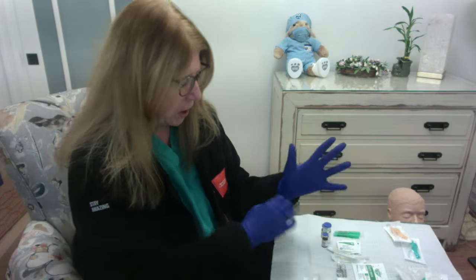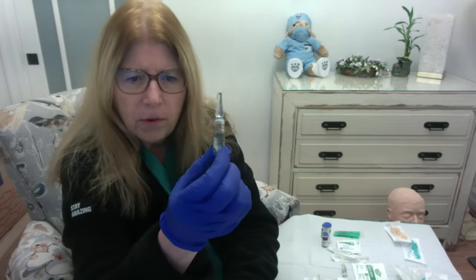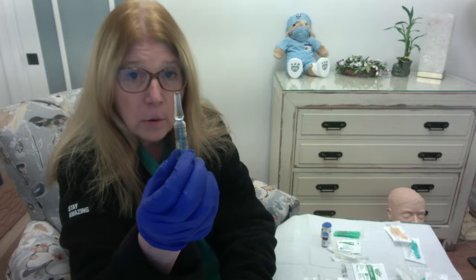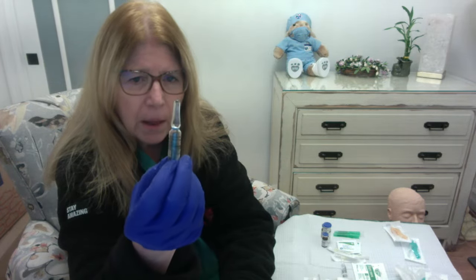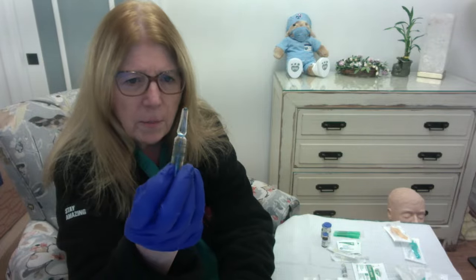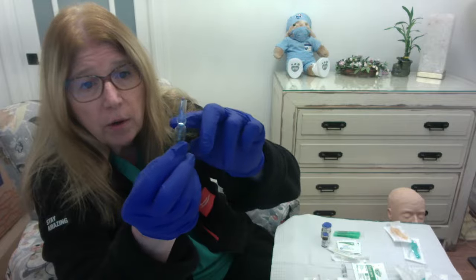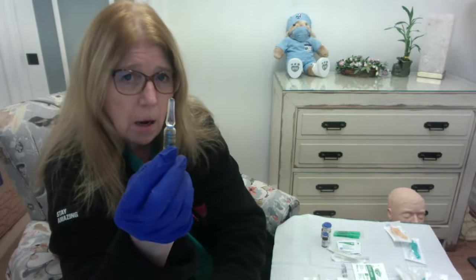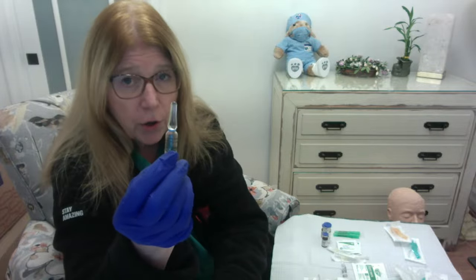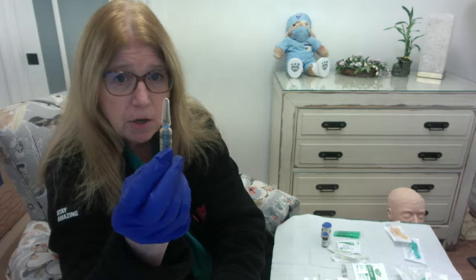An ampule is a glass container. Literally, it is a glass container. Oftentimes they come in a brown color because the medication that's in there has to be protected from light. Of course, it has all the information about the medication written on it. And then I want you to notice here that there's kind of an indentation. We call this the neck of the ampule. And essentially, you're going to be breaking the neck in order to get the medication out.